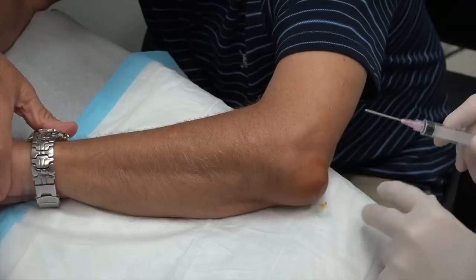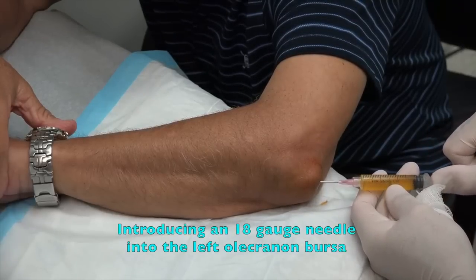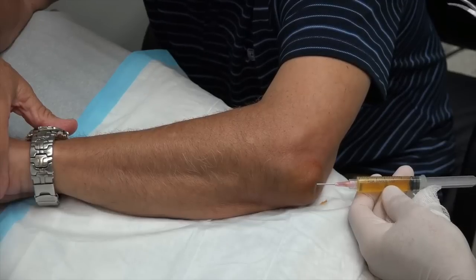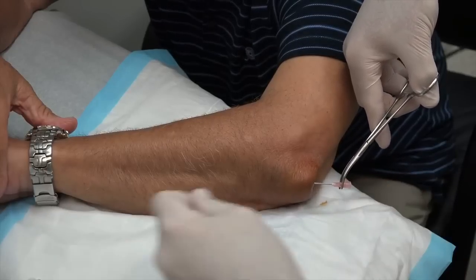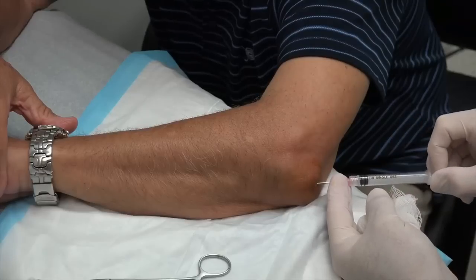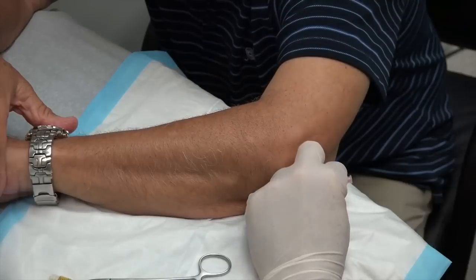Here we go, my friend. You ready? This shouldn't hurt — a little stick right there. Did you feel that? No. Good. Oh, look at all that coming out of there. See that golden colored fluid? Hemostat, please, ma'am. You weren't expecting that much, were you? Not really. Now we're going to grab onto the needle here. Amazing how the body protects you. Oh look at that — we've got more. I have another one.